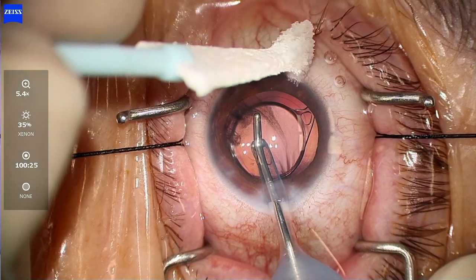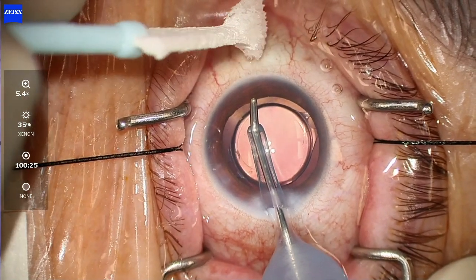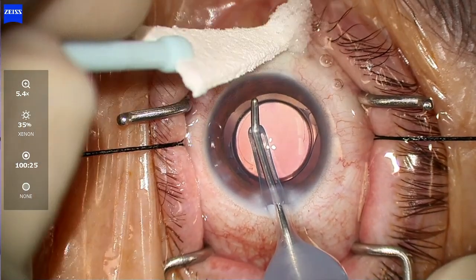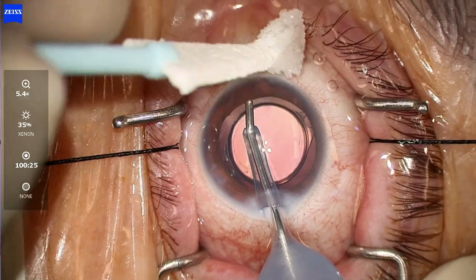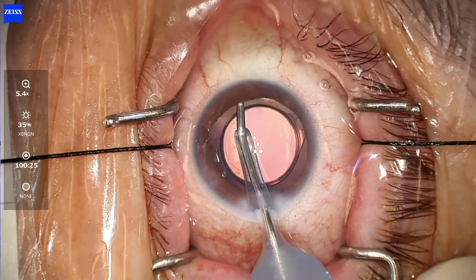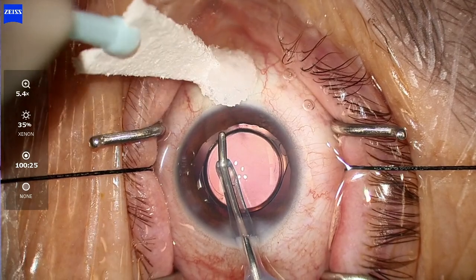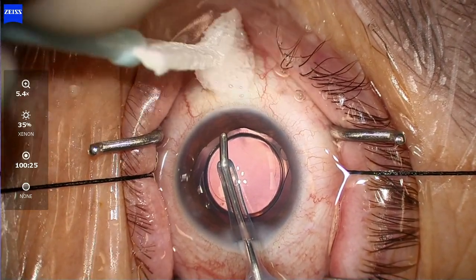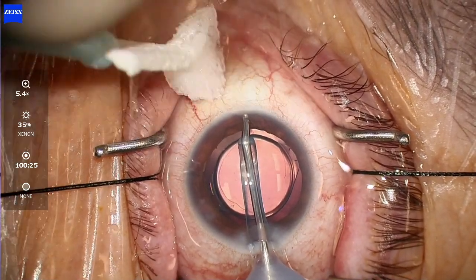Looking at the entire nasal angle here — almost more than 180 degrees — we see significant blanching, which is pretty cool. We're hedging our bets: we don't know exactly where the collector channels are, but data shows they're distributed mostly in the nasal angle while also being present 360 degrees around. There may also be areas of collapse, which is why having three stents gives us the best chance of accessing the collector system.